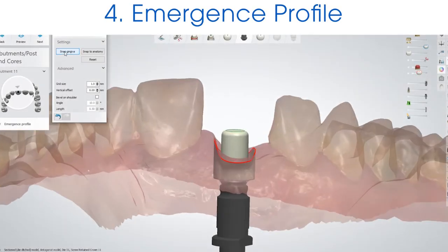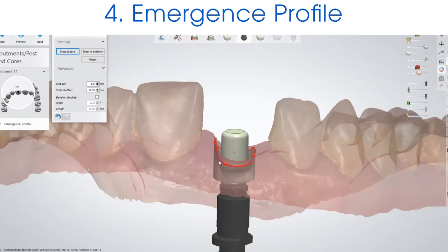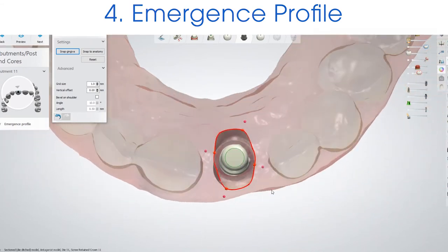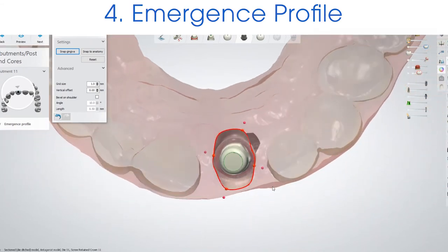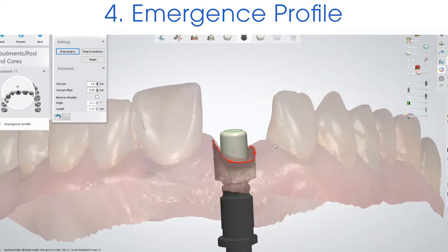Step four is the emergence profile. I like to use the 'snap to gingival' option — you can see that it adapts to the tissue really well.